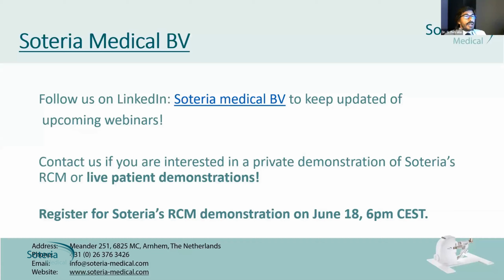Yes, I can tell you, I've been using the MR-compatible needle from the beginning, which was extremely useful with the manual system, because the manual system, in my experience, was less precise, so I had the opportunity to scan, to acquire images with the needle inserted. So I was able to see where I was going. With the new system with Soteria, it's not necessary, and we have tried other non-MR compatible needles with similar results. So there's no need at all with the Soteria system.